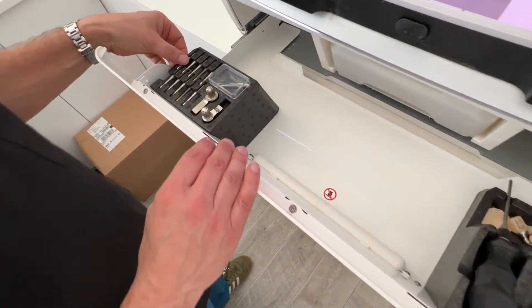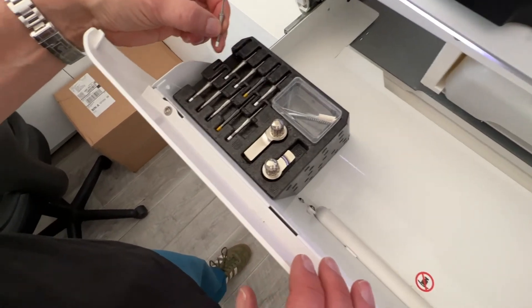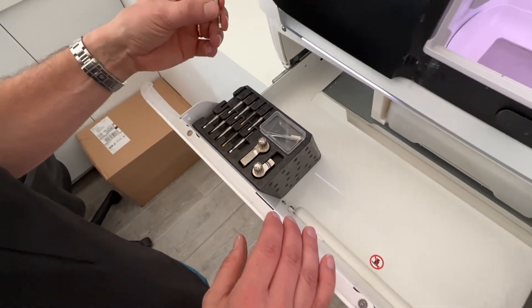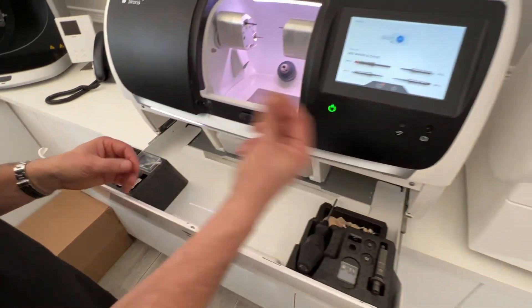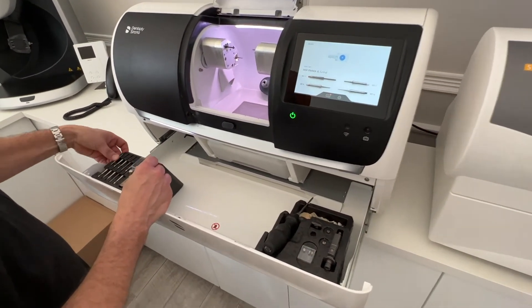On the other side there's space here to have your burrs set up. Obviously the burrs are slightly different on the PrimeMill — these have to be read in with the RF reader.